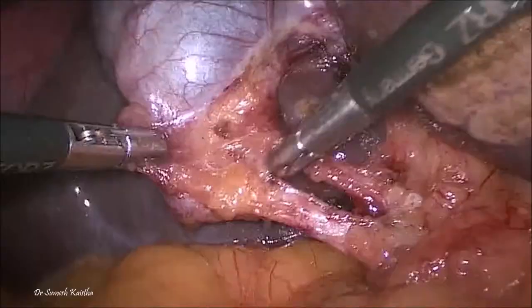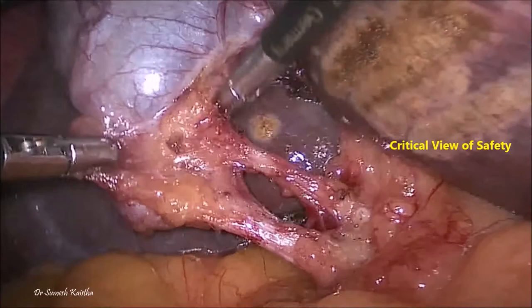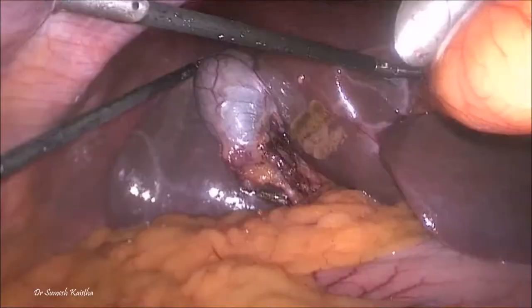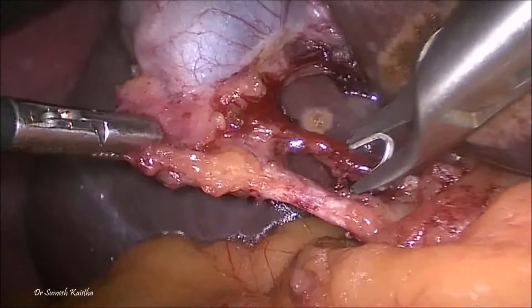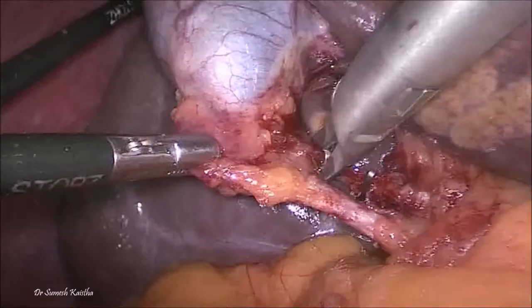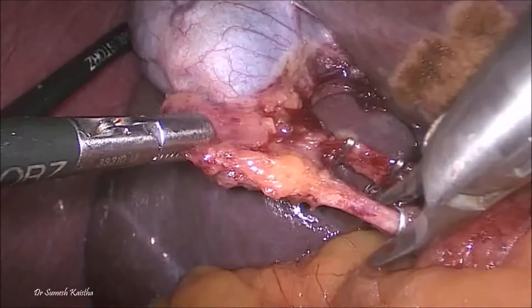After adequate dissection of the gallbladder, only two structures should be seen entering the gallbladder, which is the critical view of safety. The artery is first clipped and divided because it gives extra length to the cystic duct, especially if it is short.